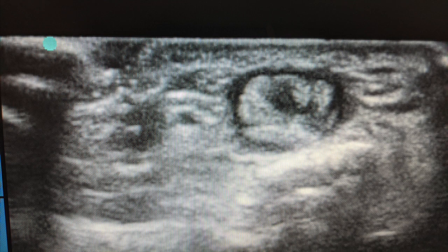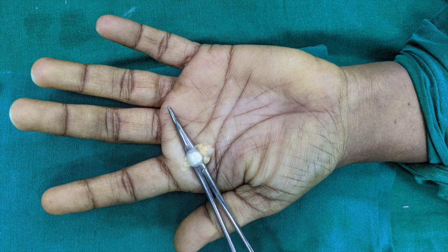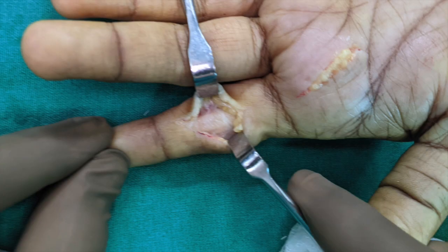In cases of tenosynovitis, an intraoperative ultrasound may help in identifying the extent of the pathology, like in this patient where an additional incision was made distally to excise the hypertrophic synovium.